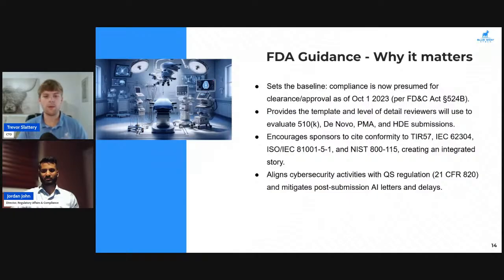So before, cybersecurity requirements were very thin. Now they're trying to refine the process. And so the latest major update was actually this Friday, which we'll talk about in a little bit here, what that update means. But the FDA guidance is going to provide essentially the templates for what documents are required, what should be included in each of those documents, and then what level of detail is expected as reviewers are going through this evaluation process. Since again, it all comes back to that risk-based approach, it's going to depend on your class of device, what type of submission, things like that.